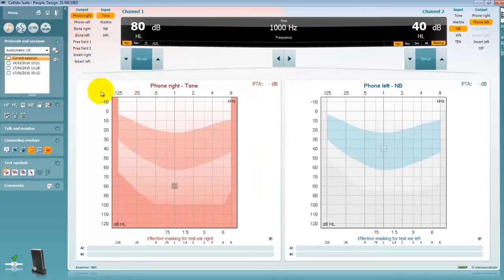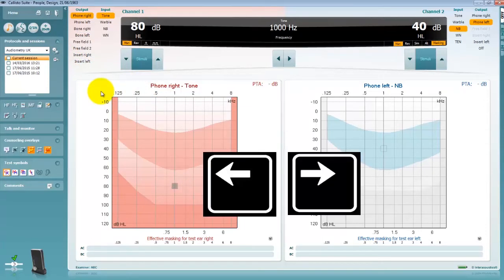The frequency is changed by clicking on the horizontal arrows in the suite or by use of the left and right arrow keys.